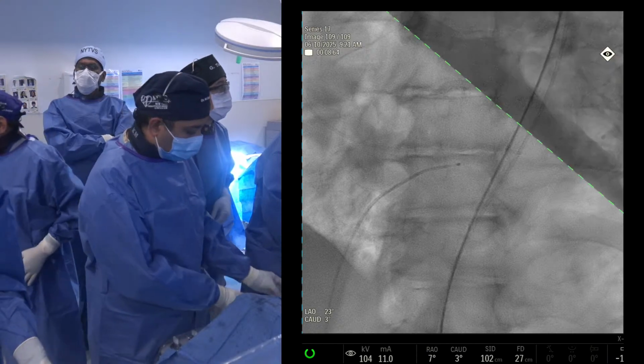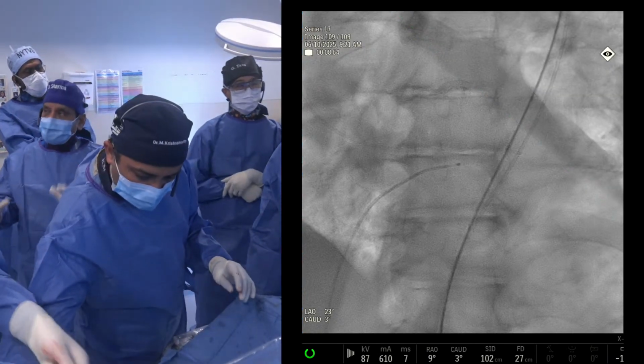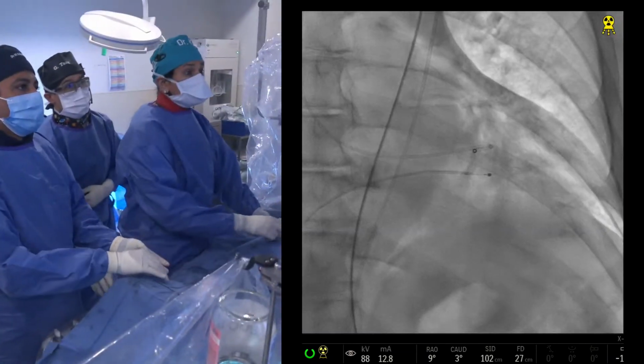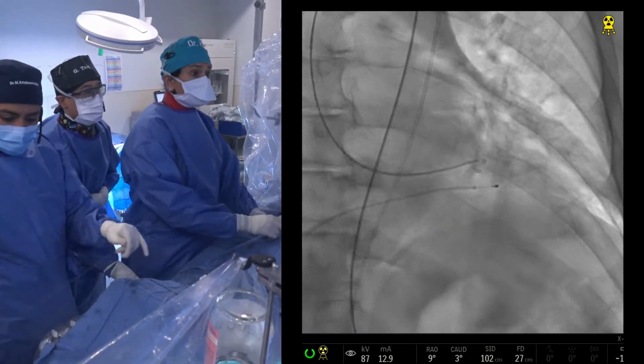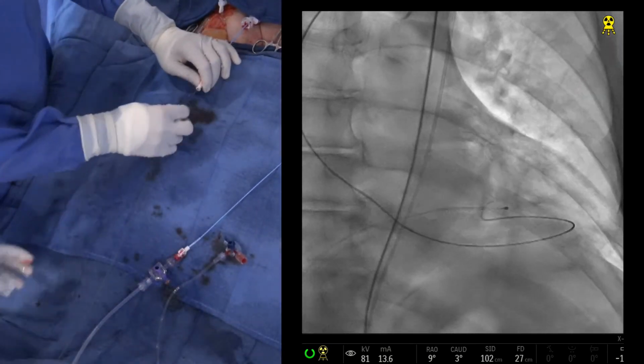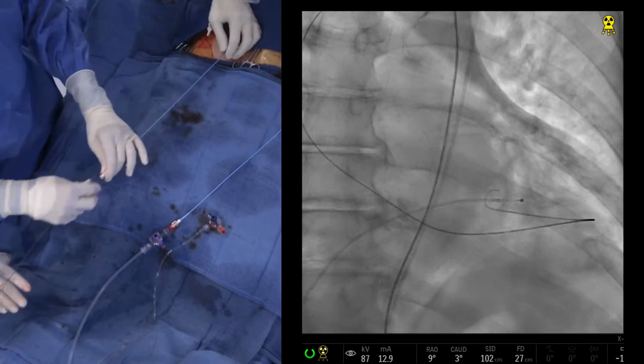So this is where the issue comes down. But our teaching basically has been that, particularly if you're talking about a self-expanding valve, we do the PCI after, because many times we find out only after the angiogram. And that is what the COMPLETE TAVR trial is.